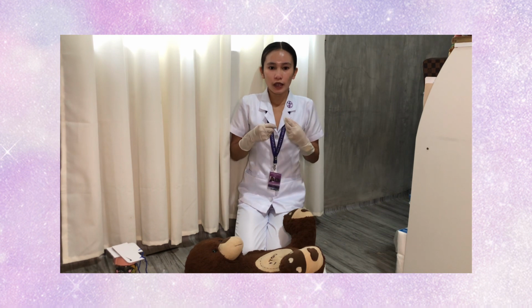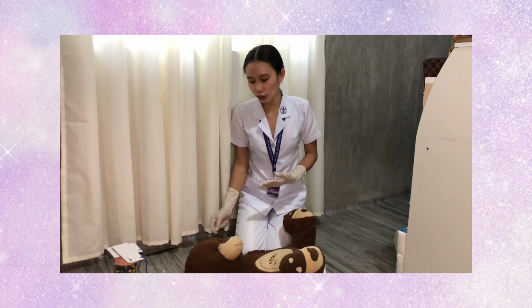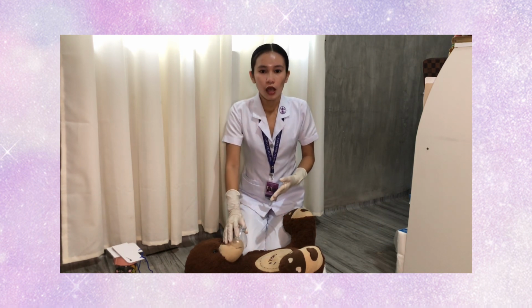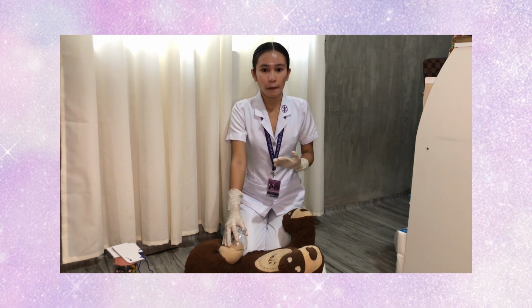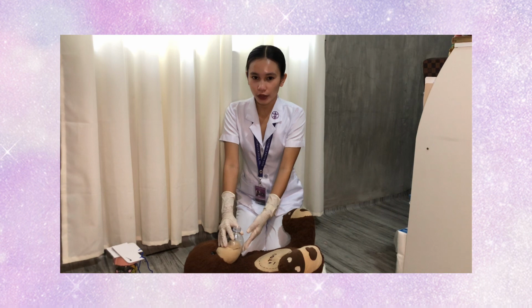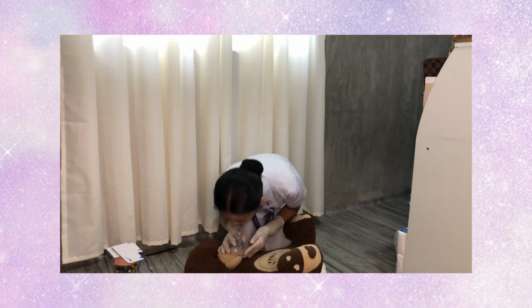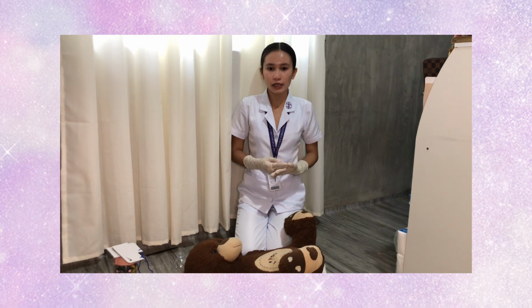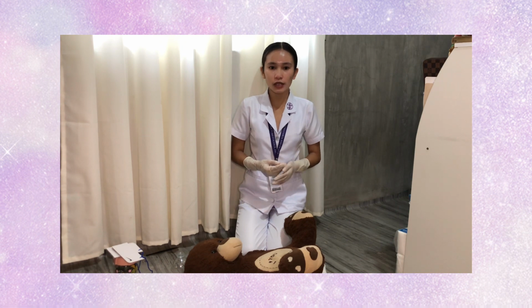After doing the chest compressions, immediately give 2 rescue breaths to the patient. I am going to use the bag mask or barrier device and cover my patient's mouth and nose with it, and hold the head tilt and chin lift to deliver the rescue breath. Each rescue breath should be given over 1 second and there should be a visible chest rise for each breath. Now after doing that, we continue the chest compressions and rescue breaths until the AED arrives or emergency responders take over.